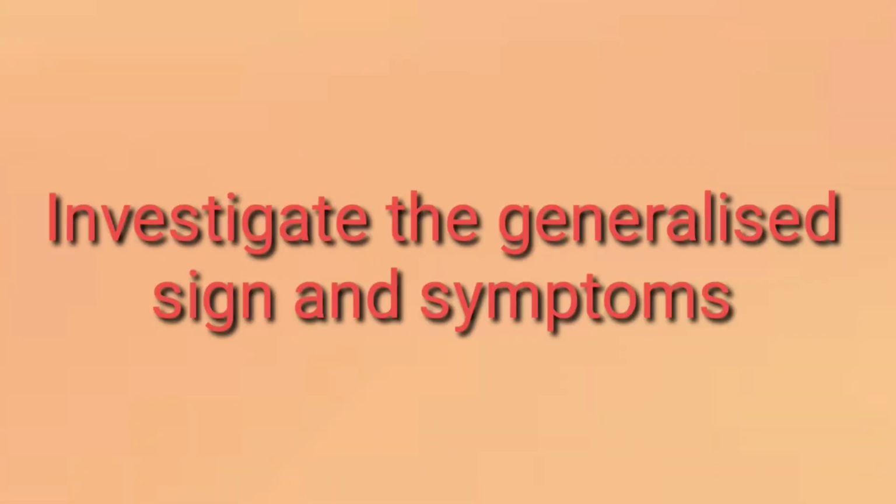Mammography is not recommended for the investigation of generalized signs and symptoms. For example, if a woman has cyclical mastalgia, for example during menses, if she feels pain or heaviness in the breast, mammography is not recommended.